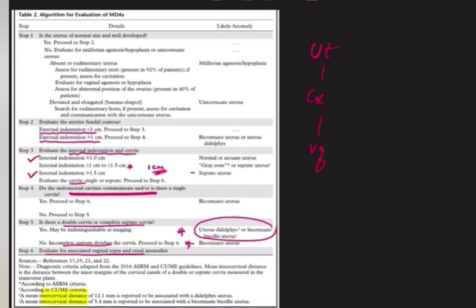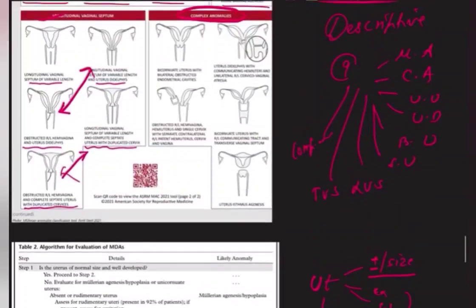In summary, look for the uterus — presence and size, ruling out agenesis and hypoplastic uterus. Then look at external indentation, internal indentation, the cervix, and the vagina. According to all these criteria, classify into the nine categories.